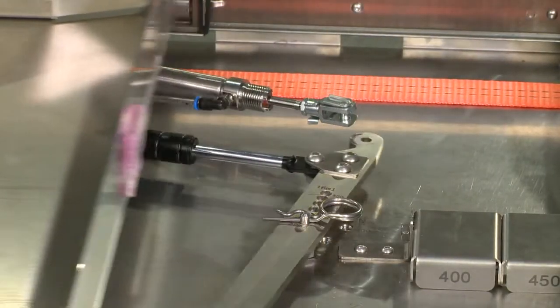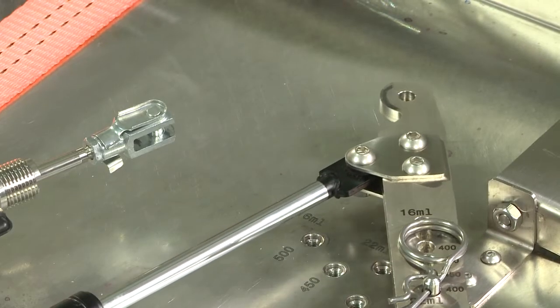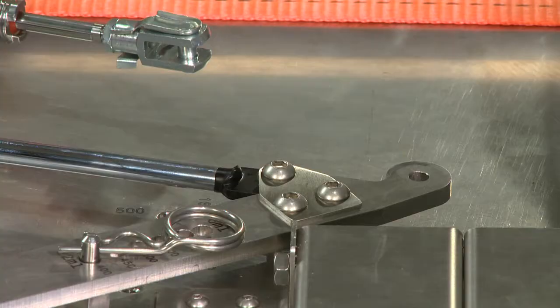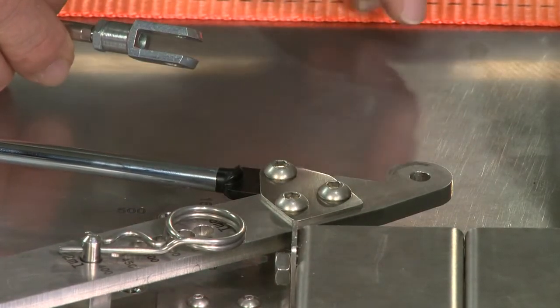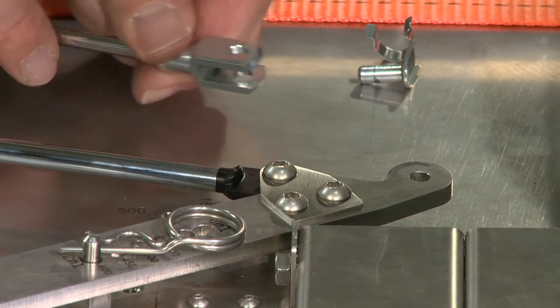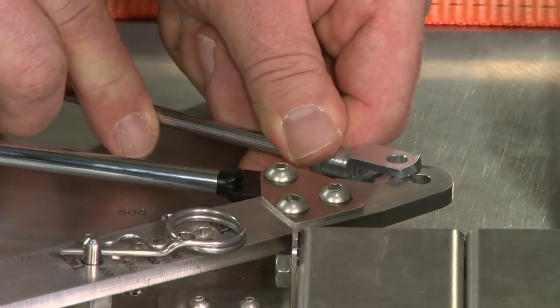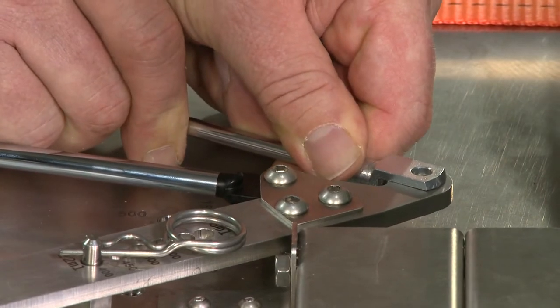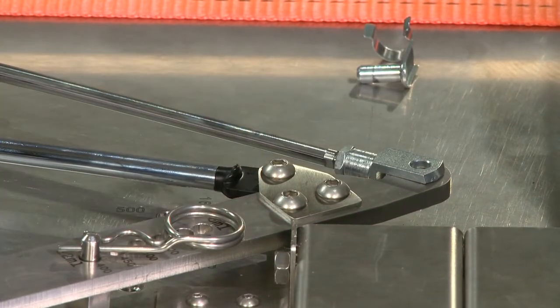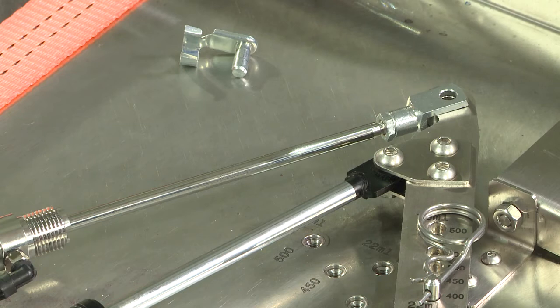The pump cylinder, which is located below the drawer, has to be connected with the lever arm before operating the device. This cylinder is separated from the lever arm on delivery. To connect both parts, pull the drawer out until it stops. Slide the cylinder to the right and angle it until the end of the cylinder overlaps the end of the lever arm construction. The two parts are in the correct position when it is possible to see through the hole.